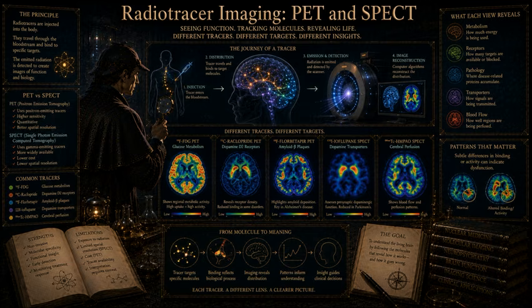When 511 keV gamma rays pass through biologic tissue and bone, they don't always travel in a perfectly straight, unimpeded line. The vast majority of interactions they have with the tissue result in what is called Compton scattering. Walk me through Compton scattering. Imagine throwing a rubber bouncy ball through a dense forest. If you throw it, there's a high probability it will strike the trunk of a tree.